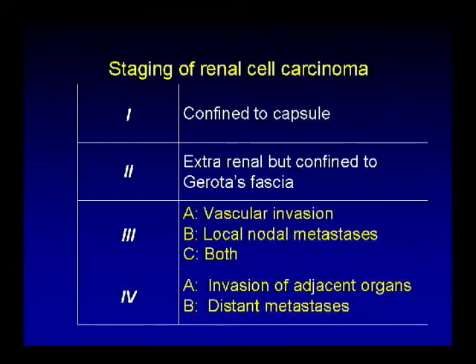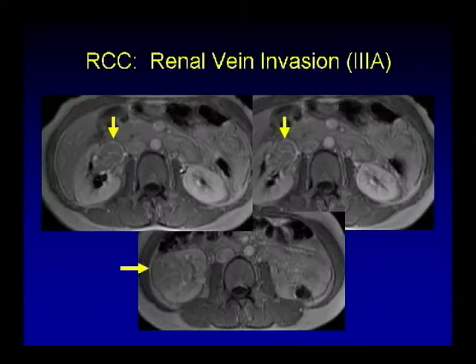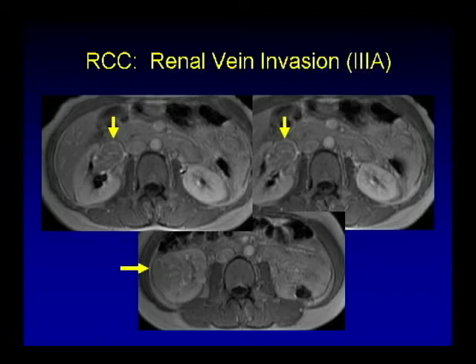On oral boards, it's not enough to stop when you identify a renal cell carcinoma — always look for other findings so you can give proper staging. Here's an example: a T1-weighted post-gadolinium image demonstrating a solid enhancing renal cell carcinoma on the right, and you notice the tumor thrombus expanding the right renal vein. Renal cell carcinoma with renal vein invasion — stage 3a.